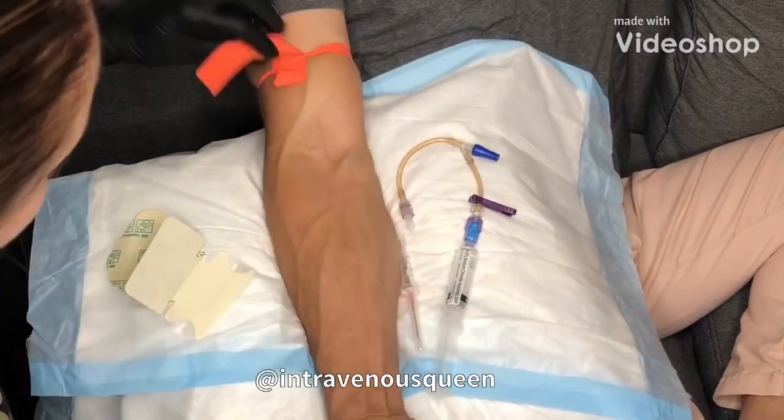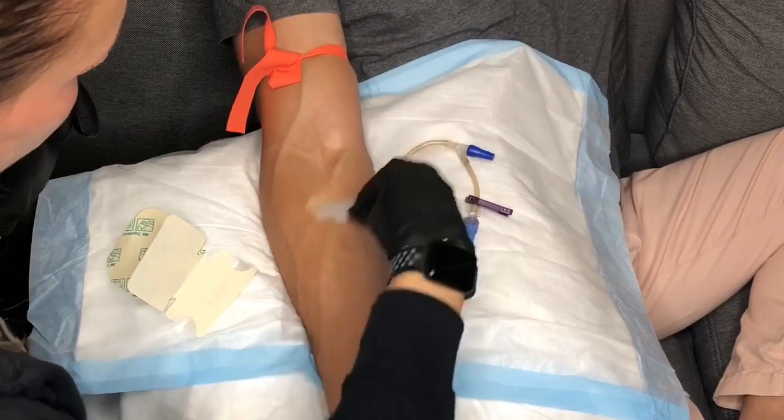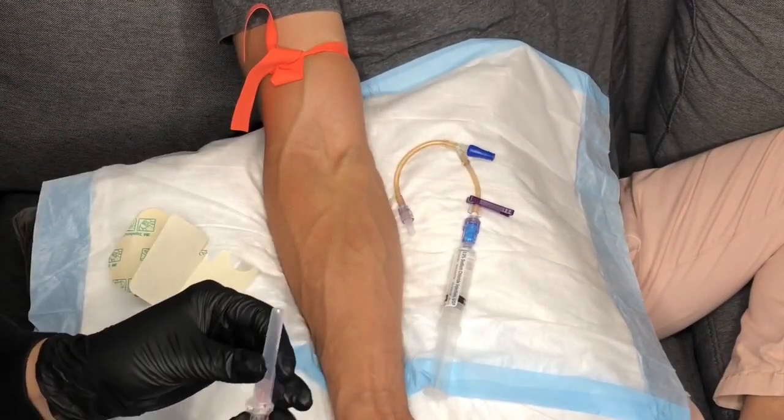In this video, we will be demonstrating how to place a peripheral IV using a 20 gauge angio with extension set tubing.